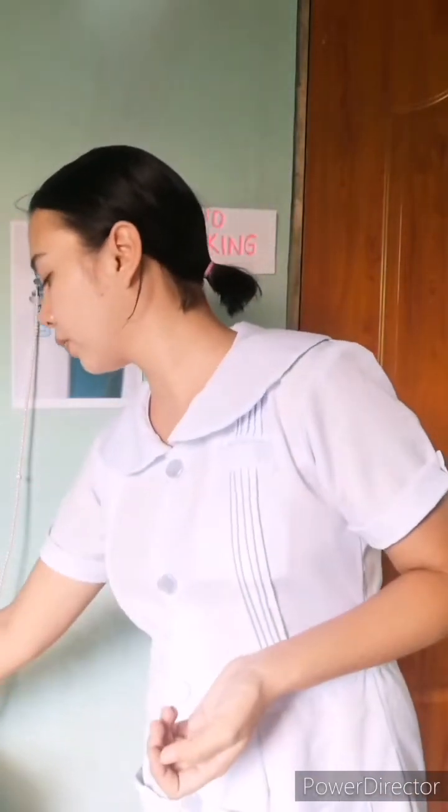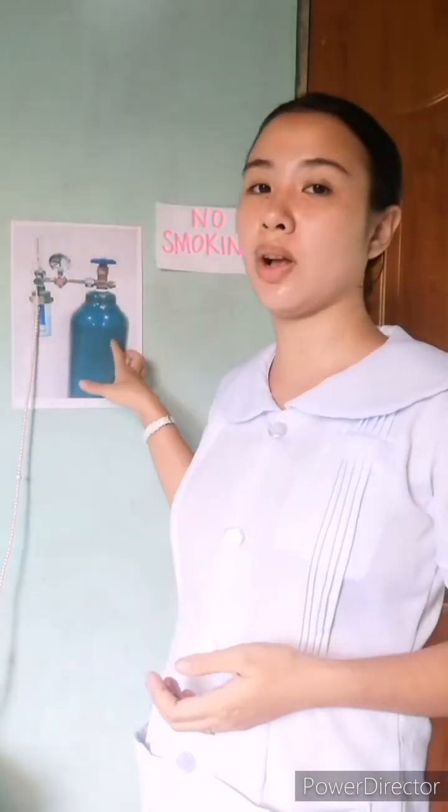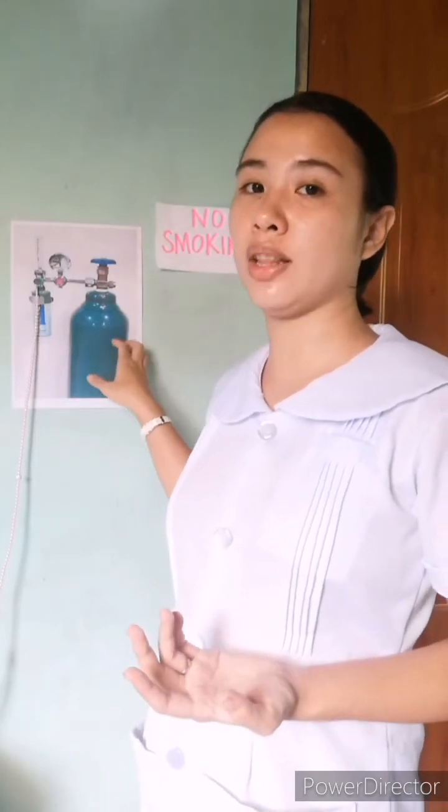So we also need padding for the elastic band so that it will not cause pain and irritation to the patient's skin. So we also need an oximeter so that we can check the oxygen level of the patient. So we also need an oxygen tank. This is very important because this will be the one that will provide us the oxygen that we need.